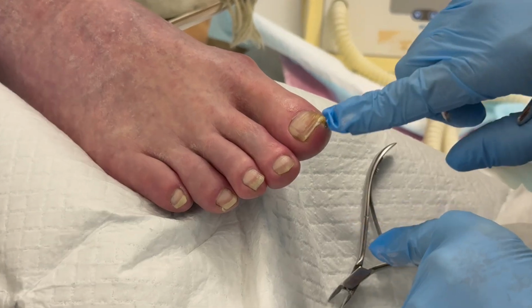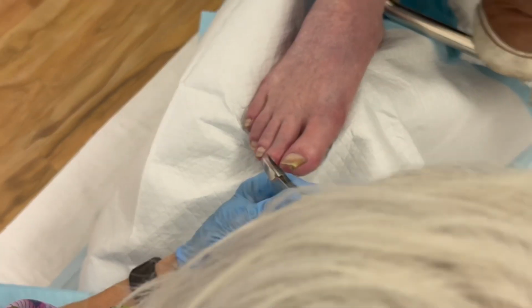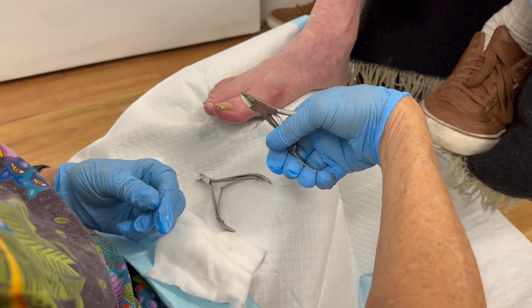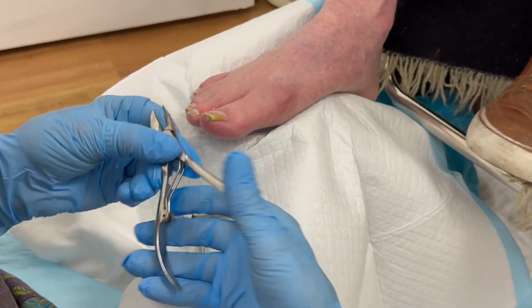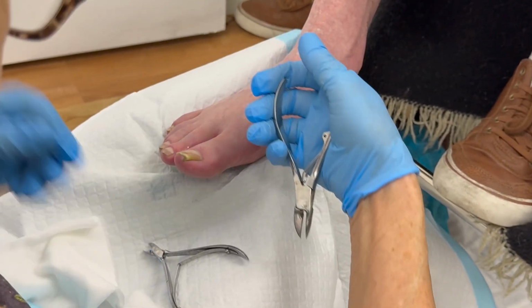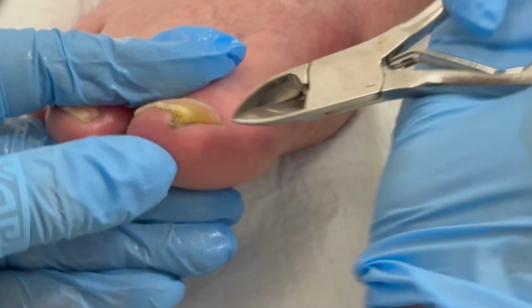Okay, so I'm going to go into this corner. Let me switch sides. Alessandra's, yes, we are experimenting here. Usually 90% of the time I'm using the nippers like this, going across in small bites. But when I'm going into a corner, I turn it around upside down. I am going to get as much down in this corner. My goal is to get way down here and get this whole corner out.